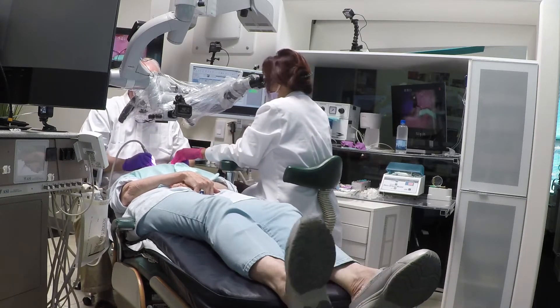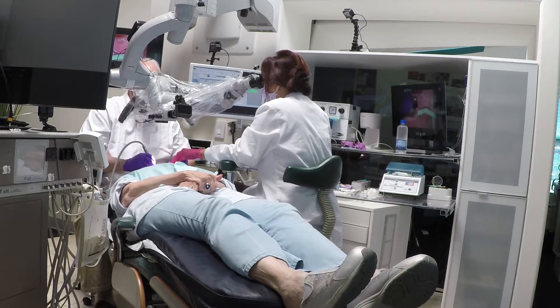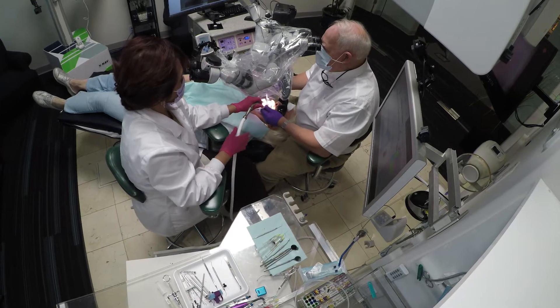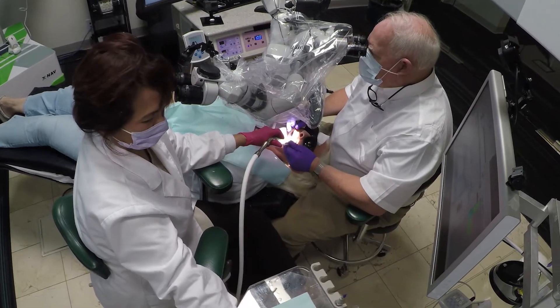It gives a little more room for her chair, and she can sit completely upright and be perfectly comfortable. Here from another angle, you can see that she is sitting completely straight up.